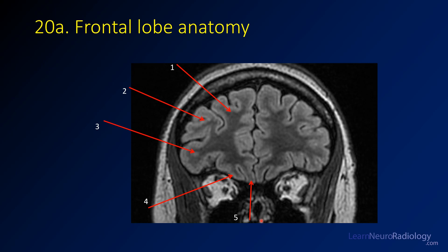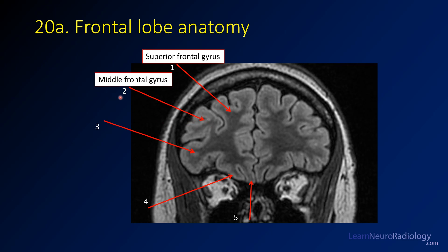These are the gyri of the frontal lobes. What you're looking at is a FLAIR image, a coronal image through the frontal lobe. Your first structure here is the superior frontal gyrus. And then as you move laterally, this one is the middle frontal gyrus.